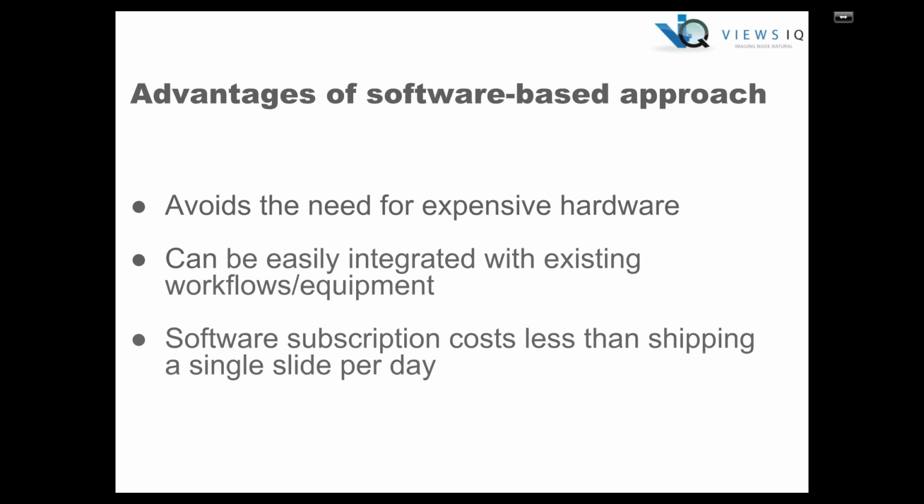Panoptic can be easily integrated with your existing workflows and equipment. And because there's no expensive hardware associated with it, a software subscription can be offered for less than the cost of shipping a single slide per day.